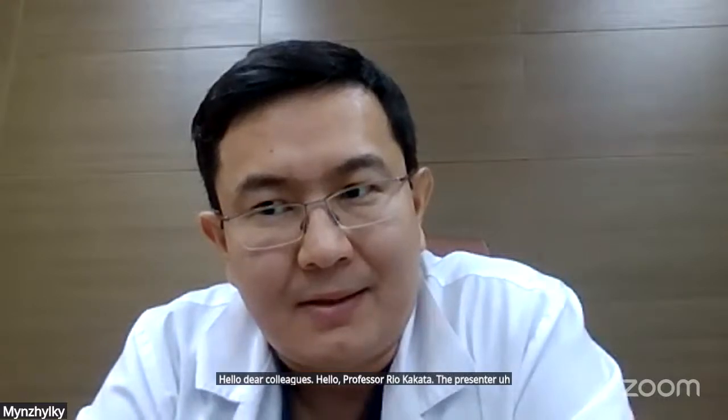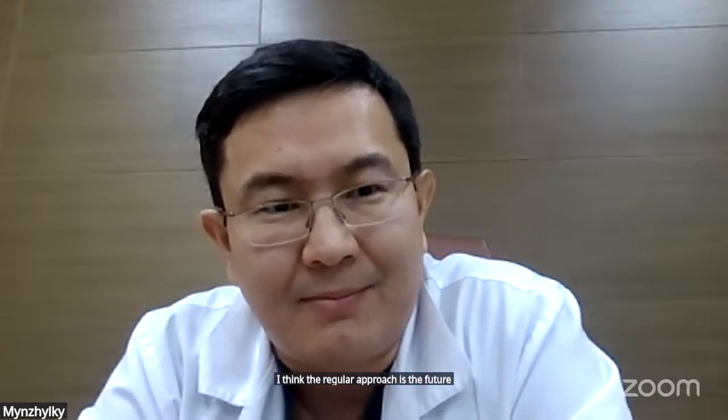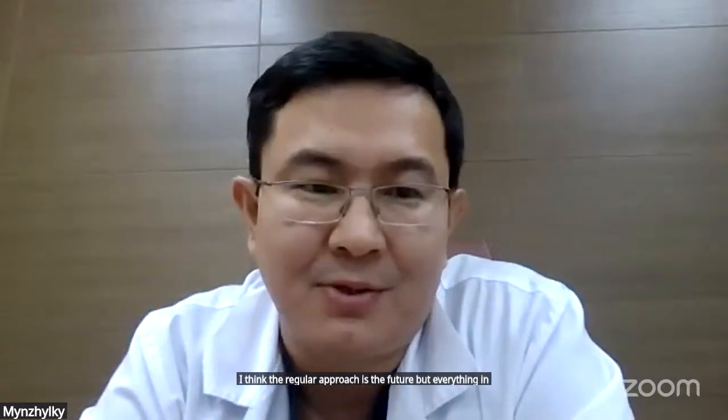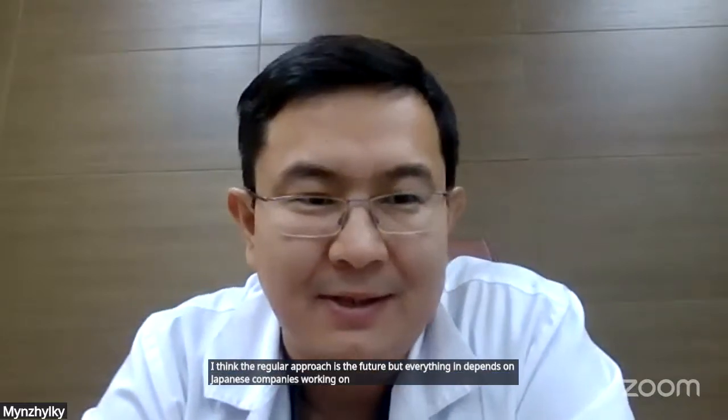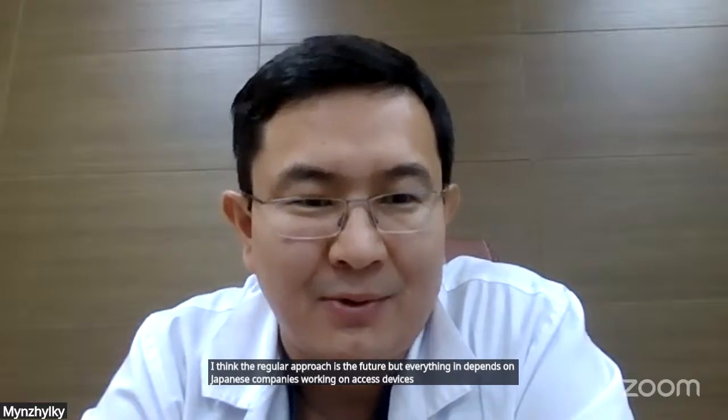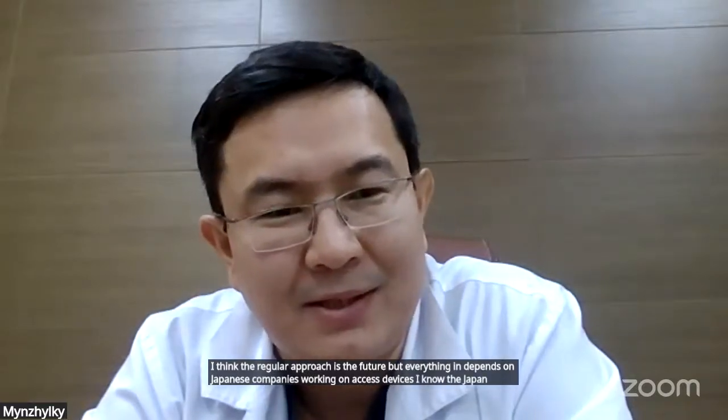Hello, dear colleagues. Hello, Professor Yokakata and the presenter. I think the radial approach is the future, but everything depends on Japanese companies working on access devices. I know the Japanese companies are the best. For the radial approach with different aortic arches, we are using the Destination catheter.